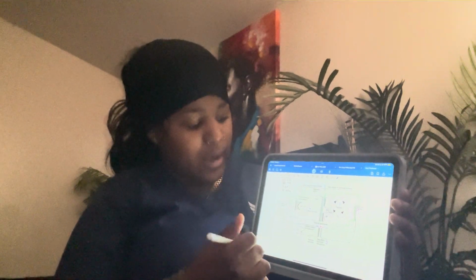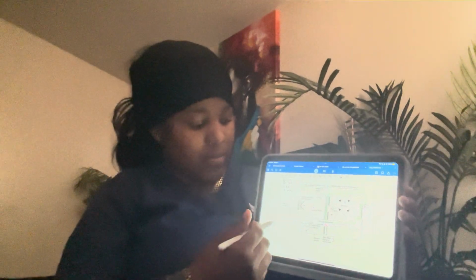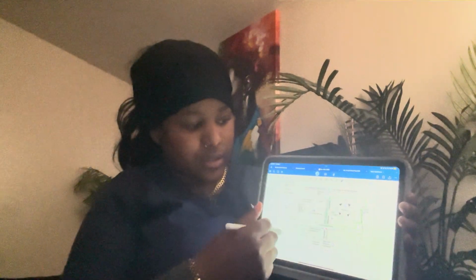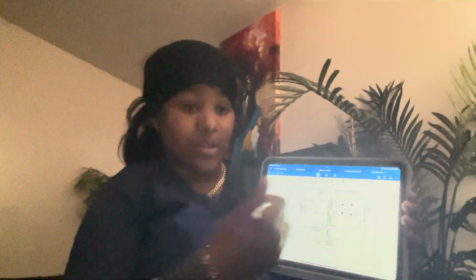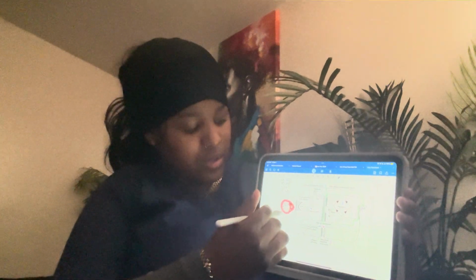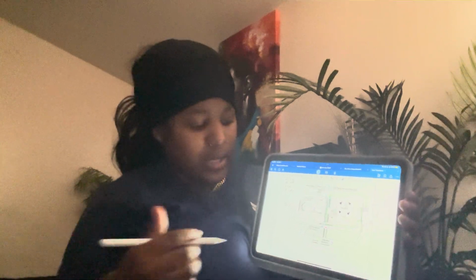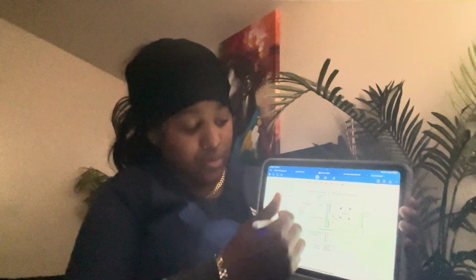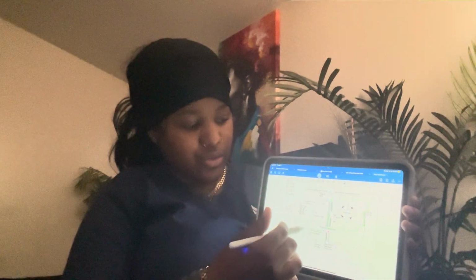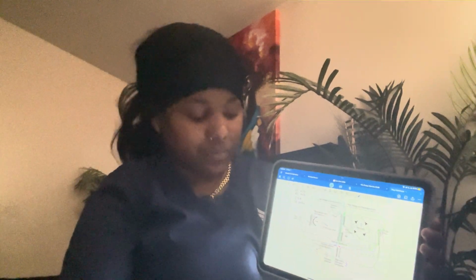The main switch is the part that allows us to flip that switch on the wall to allow incoming current to come in through the entire circuit. Now we have many different components that have a lot of different factors in why they run the way that they run. When we turn the main switch on, we are allowing that current of 220 volts to come through the circuit, allowing us to receive that current to actually process the X-ray machine.